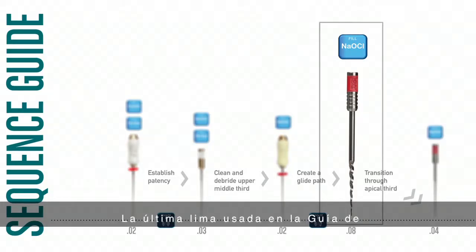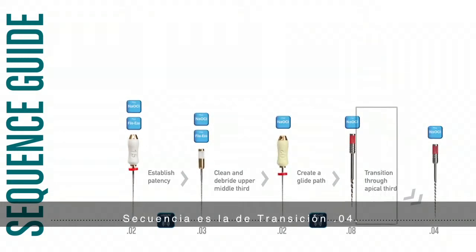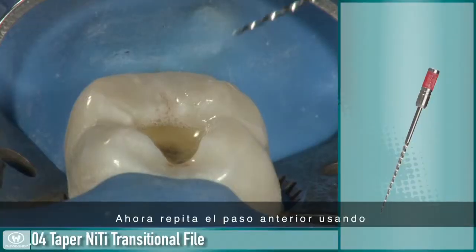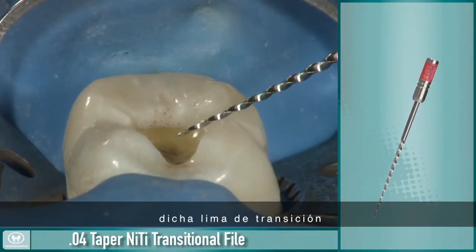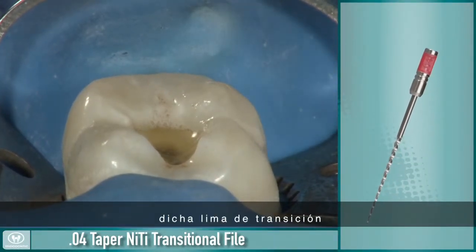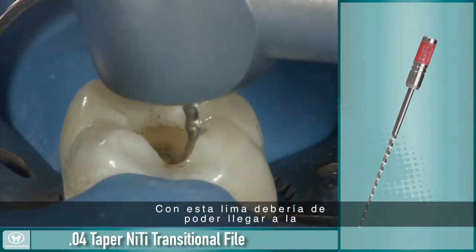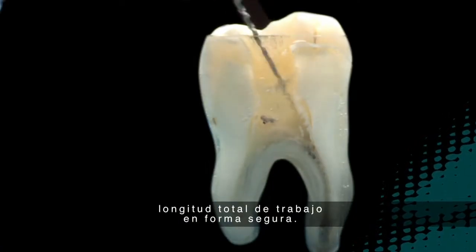The last file used on the sequence guide is the 0.04 transitional file. Then repeat the previous step using the 0.04 taper NiTi transitional file in the same manner. You should be able to safely reach the full working length with this file.